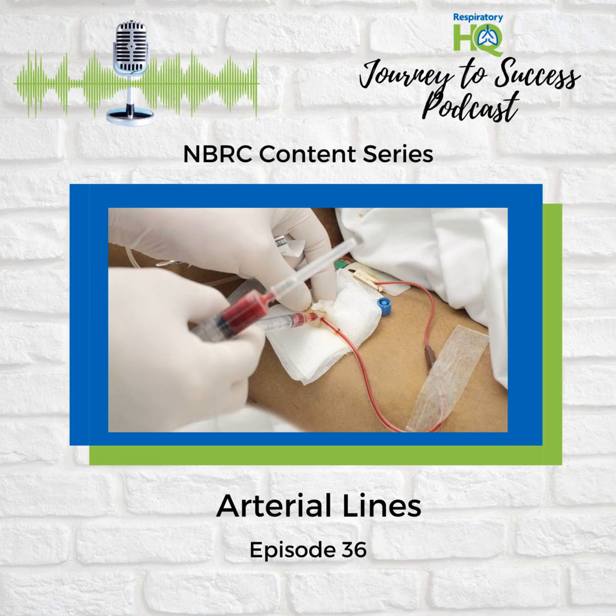Yeah, and we're just getting started. We've got to add another layer now: mean arterial pressure, or MAP. MAP, that sounds important. It is. MAP is like the average pressure in your arteries over a whole heartbeat cycle. Got it. Doctors really like it because it gives a much better overall picture than just looking at systolic and diastolic separately. So how do they even calculate this MAP number?